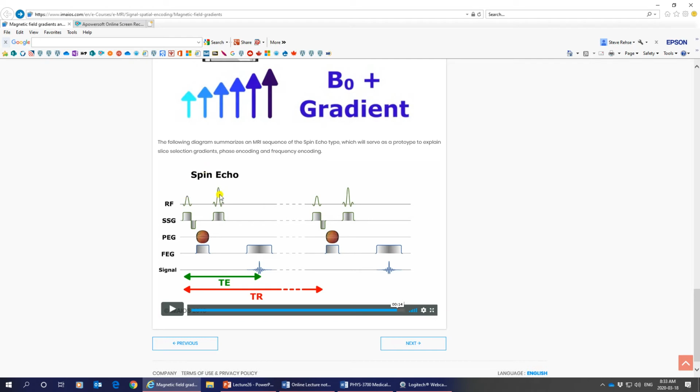This pulse here, oh, I know what that is. That has to be the pi pulse, right? The pi pulse comes at time TE over 2, look, right? So it's TE over 2 from pi by 2 to pi, another TE over 2 to the echo, and there's the echo, and that defines TE, the echo time, and you know that. You know what the echo time is.